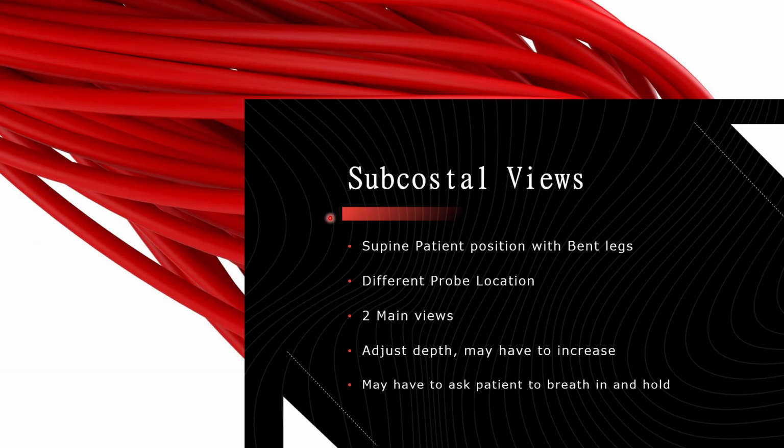Subcostal views. The patient will be supine with bent legs. This is a different probe location. 2 main views. We will have to increase our depth, and you may have to ask the patient to breathe in and hold for these views.